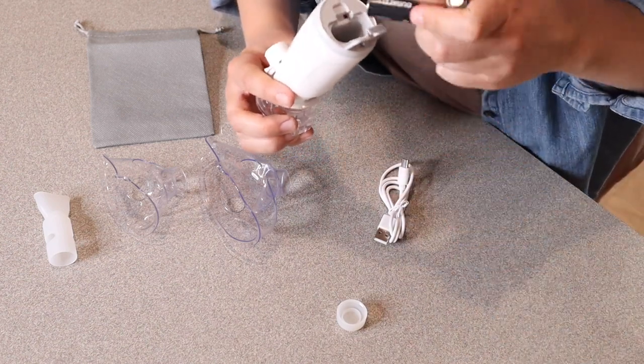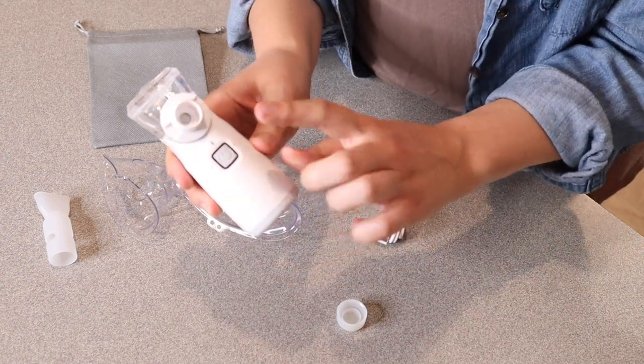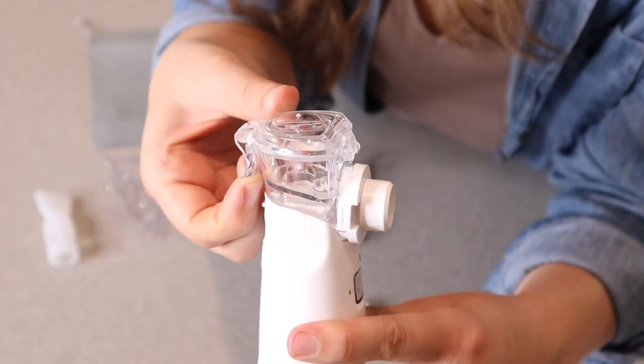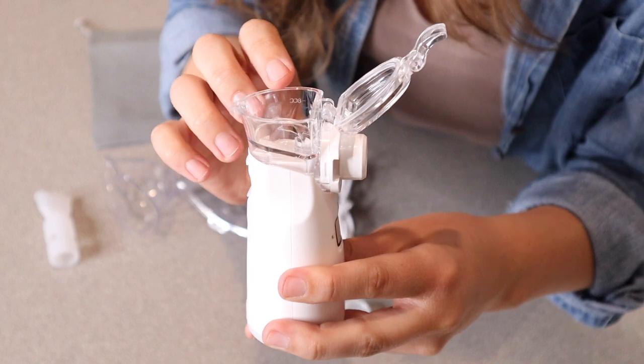So let's go ahead and assemble this. You can see you push the power button and it turns it on; you push it again and it turns it off. This little part right up here is where you're going to hold the liquid, whether that's medicine or water or whatever you are using this for.